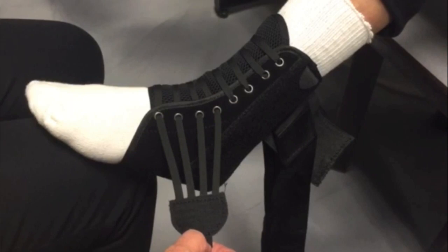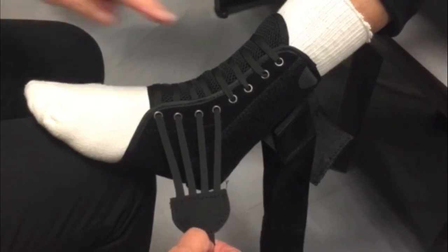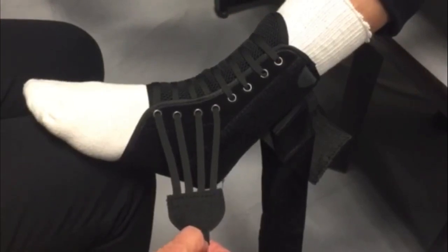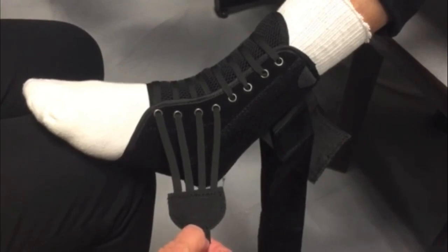We are going to demonstrate the application of the F8X Lacer Ankle Brace. The Bird and Cronin F8X Lacer Ankle Brace with stays is designed to treat and help prevent most ankle sprains. The brace fits either the left or right ankle and is designed to be worn over an athletic sock.